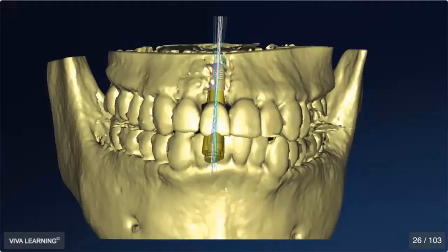What we find is that between those 3 scenarios, there's actually not a lot of difference. So CT only, CT scan with intraoral scan overlay, and then all of that in combination with a dummy tooth that a lot of the software will let you place. There doesn't seem to be a lot of significant difference between those strategies.